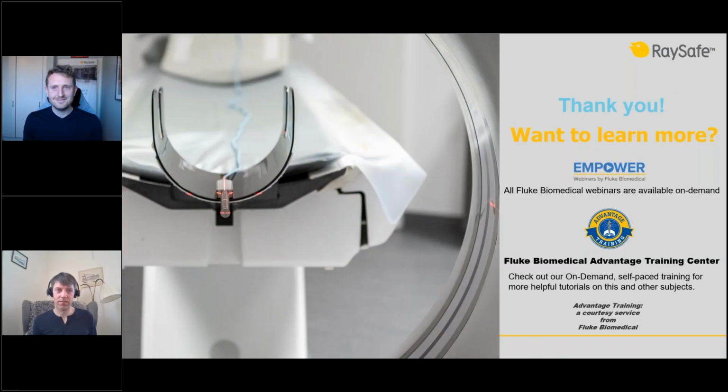One more quick question before we take off today. Is there an X-ray beam emission standard value range given the filtration? So I take this question as asking, are there standard reference values? My answer to that is the ACR quality control manual gives reference values for certain types of protocols.